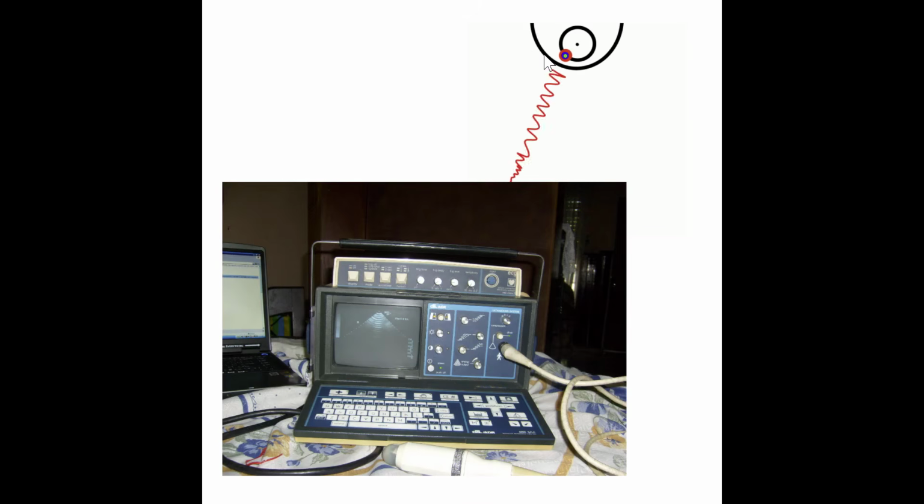And you can see in this picture up here as well, when the orange ones come out, they are only responsible for the first part. The green crystal would be responsible for the next part down in the image, blue for the next furthest part, and then red being responsible for the outermost part of the image. So the largest diameter crystal is responsible for the farthest field, and that goes back to our understanding of how crystal diameters work with focal depth and divergence.